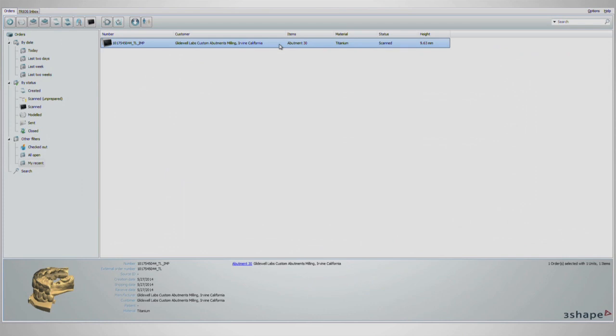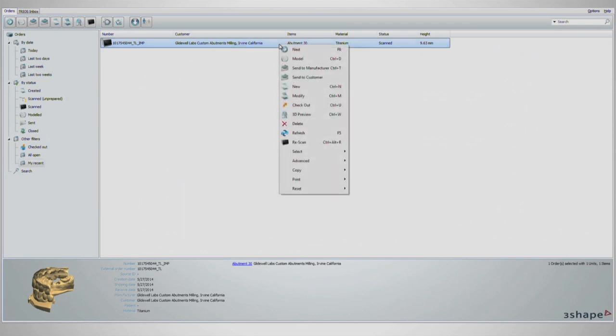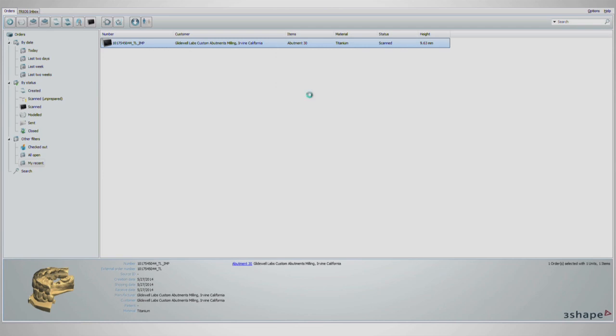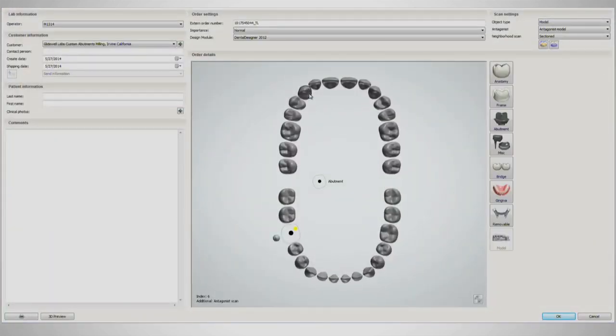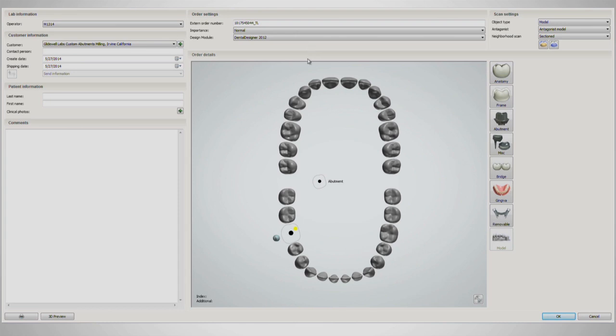To start the Abutment Design, begin by right-clicking the desired file and select Modify option. This will bring up the order form where the restoration specifics are chosen. Tooth number, material, restoration type, and so on. This screen will be seen before designing any material on 3-Shape Dental Designer.